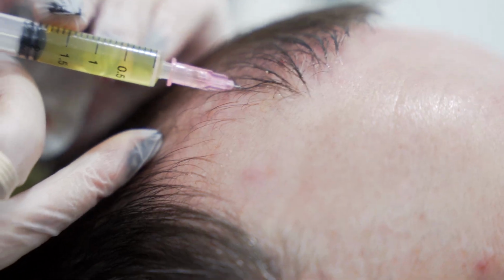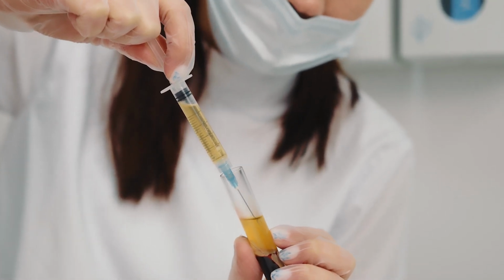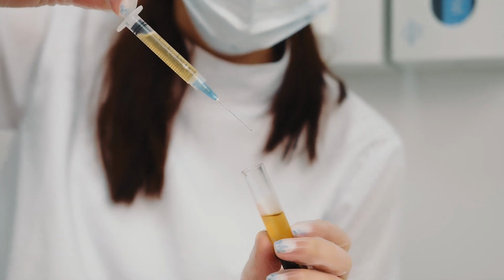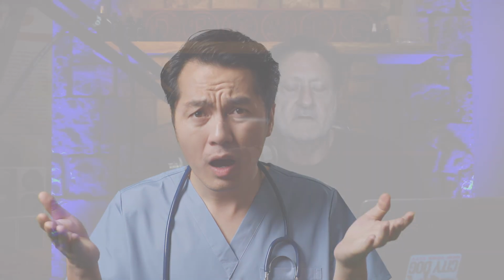I'm going to talk to you about one of the reasons injections like PRP and exosomes and whatnot may fail. And that failure is a lack of understanding of where the hair follicle is below the surface of the skin. So I'm going to use a tool to kind of show you.